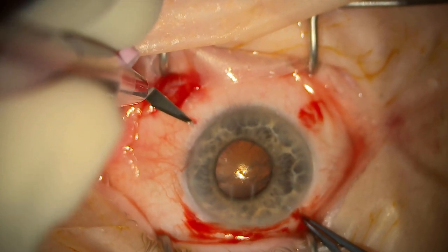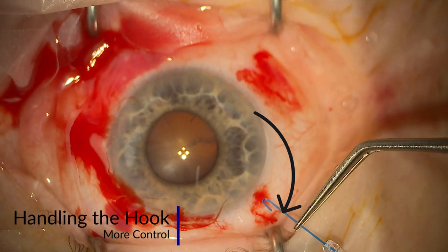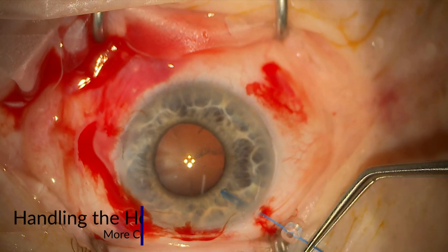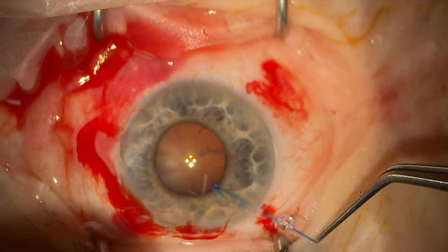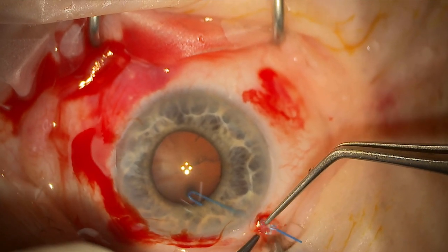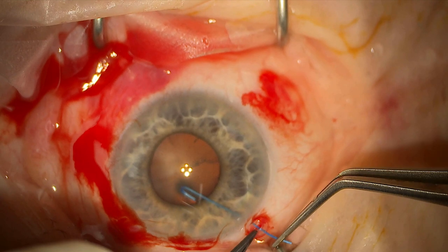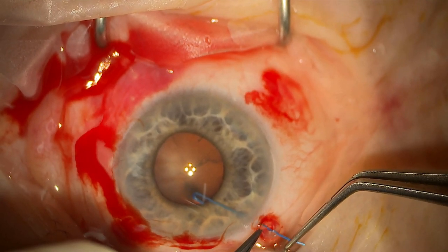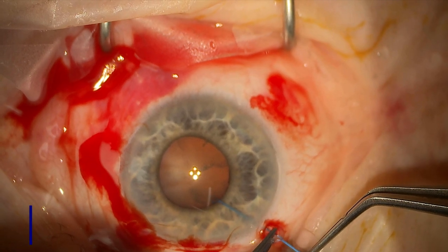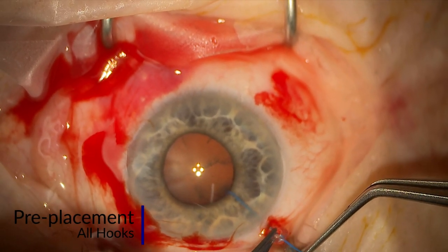Iris hooks can be quite fiddly and bendy, and my advice would be to try and hold them as close to the hook as possible when inserting into the eye, as they will bend if you're not careful. You can see here I'm using two instruments and gently inserting the hook and rotating it so the iris is being held, and I'm pre-placing each hook.